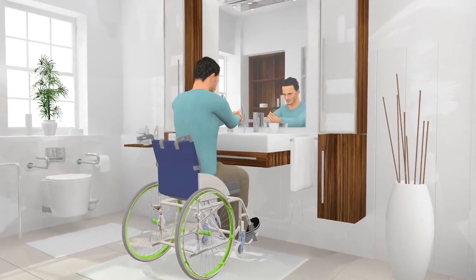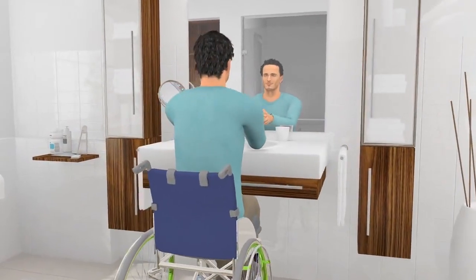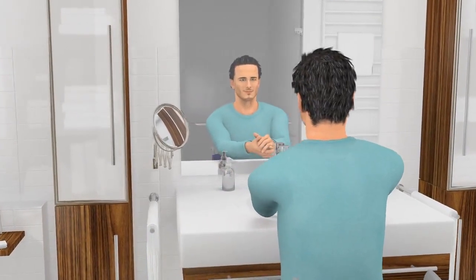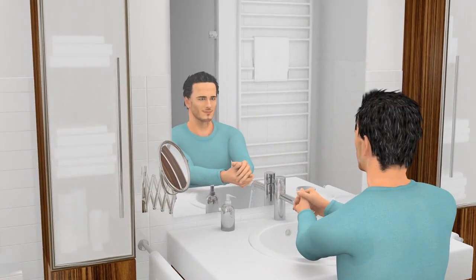In this film, you will learn step by step how to empty your bladder. It is relatively simple, but will require some practice. Start by washing your hands thoroughly with water and soap. Remember also to wash your thumbs. Alcohol hand gel can be used if you don't have access to washing facilities.